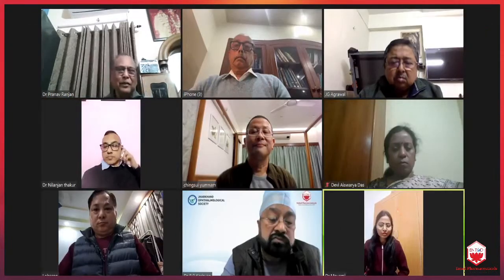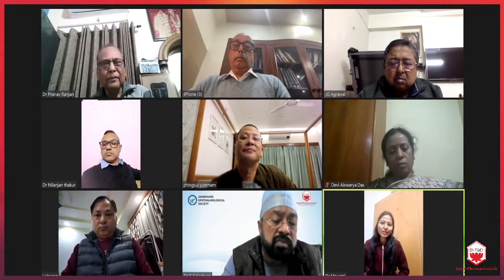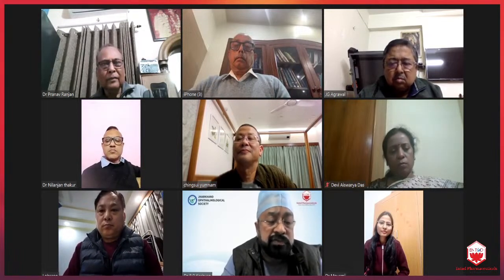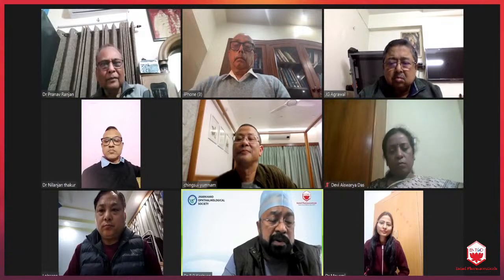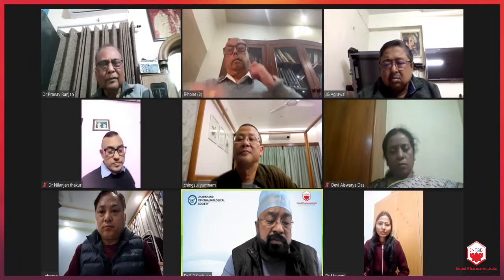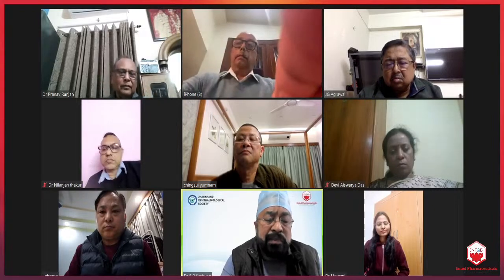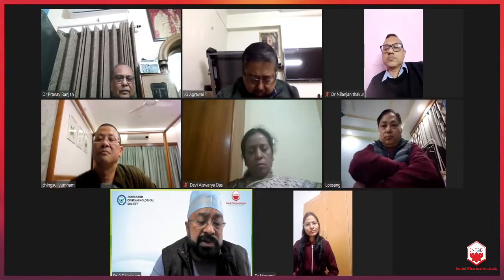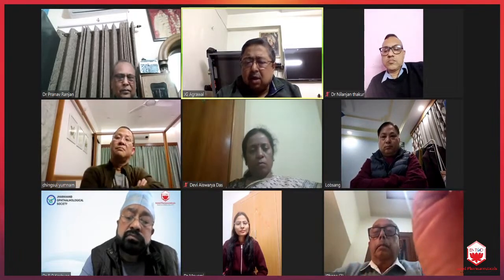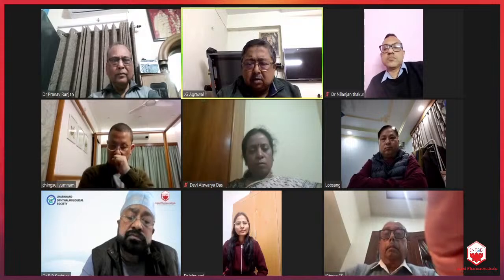Yes, sir. Good evening, sir. Myself, Dr. Mosmi. My question is, in piggyback circumstances, how will we calculate IOL power? Simple. Very simple. You calculate the power by the pseudophakic method, and then you have to add the power which comes in the refraction. It is simple: whatever error is coming, you just add it on there. Otherwise it is not very difficult.